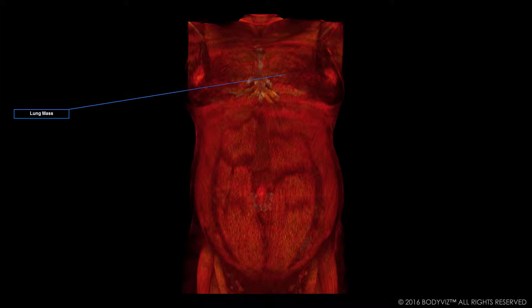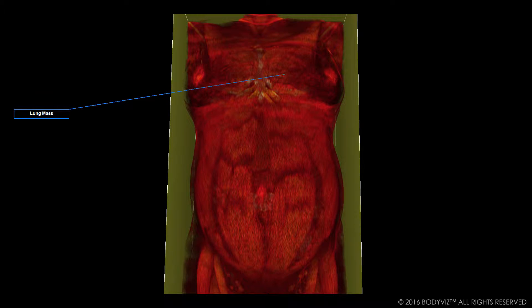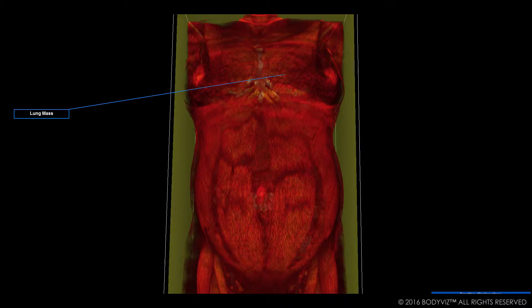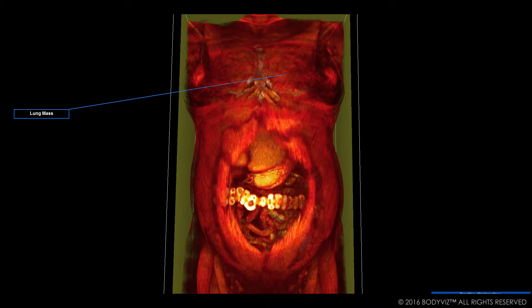Hi, I'm Celeste and I'm the content and curriculum intern here at BodyViz. Today, I'm going to reveal the answer to our Facebook anatomy challenge. I've got my study open in BodyViz and I'm going to start by adding a clipping plane to virtually dissect and reveal internal anatomy.